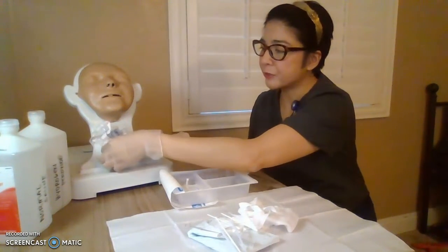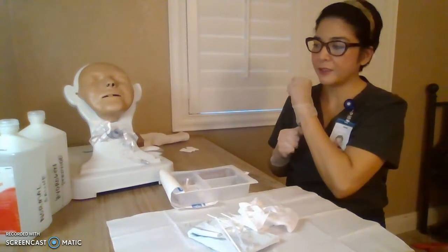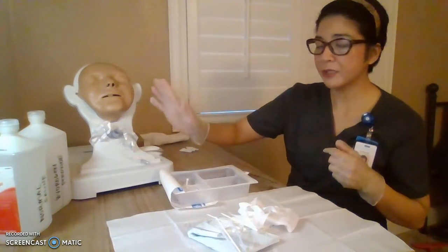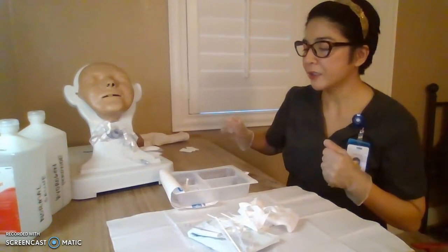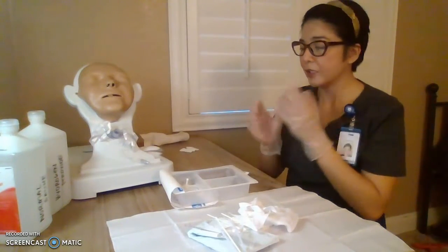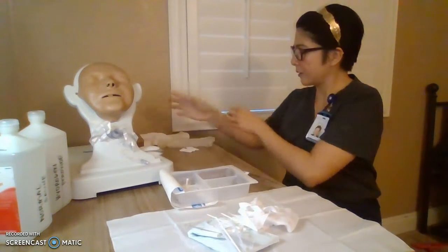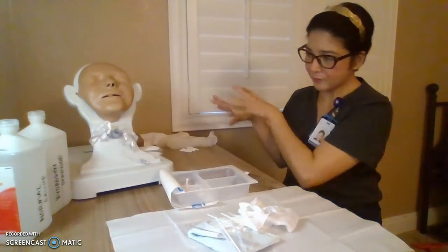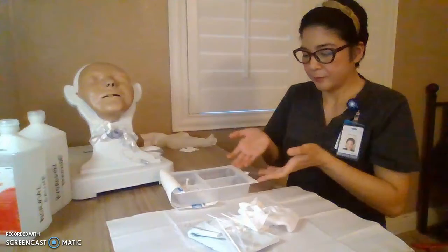And now, of course, you're going to remove your dirty dressing. Okay. And now you're going to discard. All right. So if the patient needs to be reoxygenated, look at your patient, look at your numbers, oxygenate the patient, talk to your patient. All right. So at this time, we are actually done with our clean procedure. We are now going to discard your gloves. Just throw it the usual way. Okay. There we go. Hand hygiene. And we're now going to our sterile procedure.